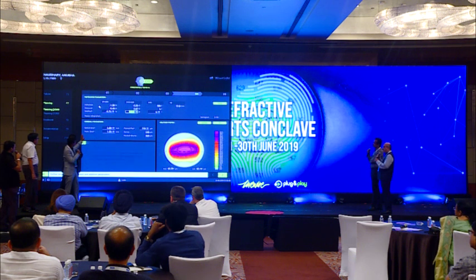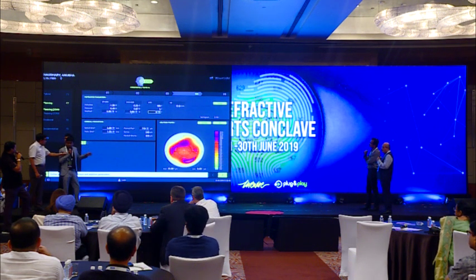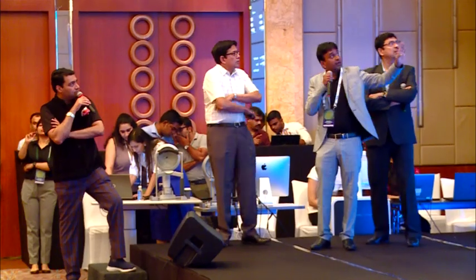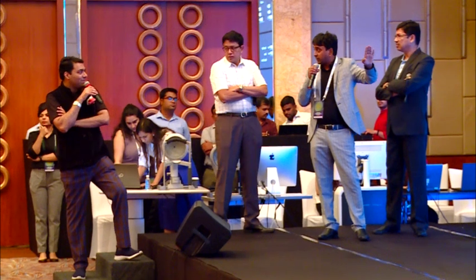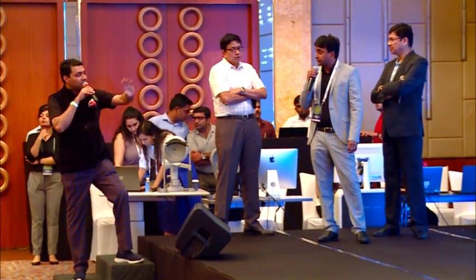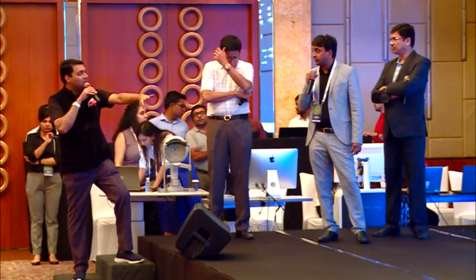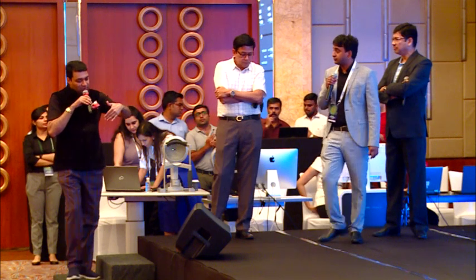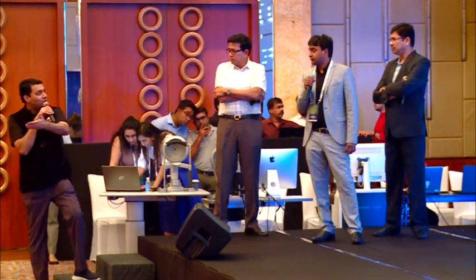What if we treat based on the manifest refraction, like the spherical with 1.5 and the cylinder remaining at 2.25? That becomes your wavefront optimized. But and just changing the cylinder axis? No, because then you will not be giving the patient the benefit of a true cylinder. That's what the whole talk in the beginning was. What is your true cylinder, which includes the aberration and your posterior corneal astigmatism?